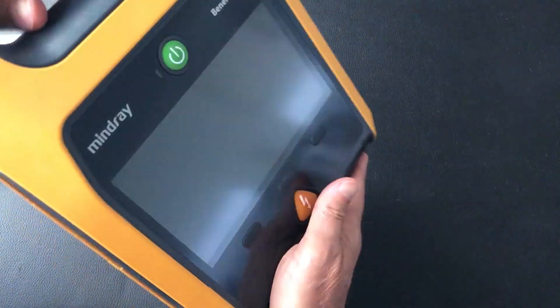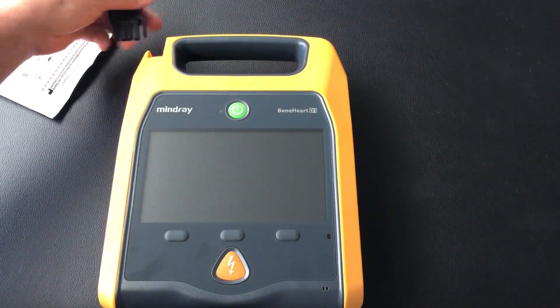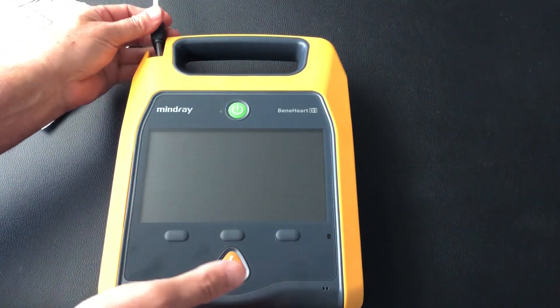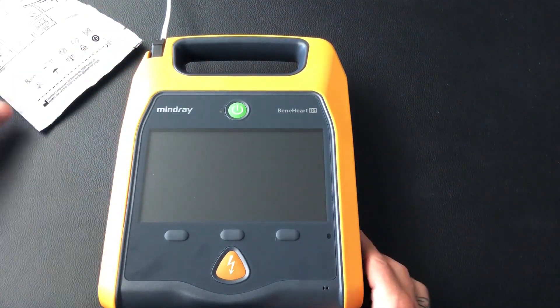Turn it back over, put the pads in — just like that — and we're ready to go.